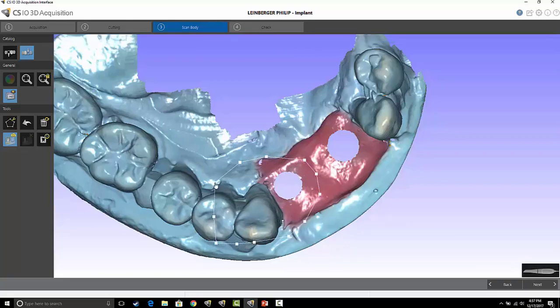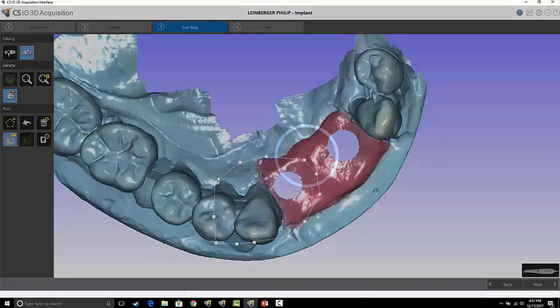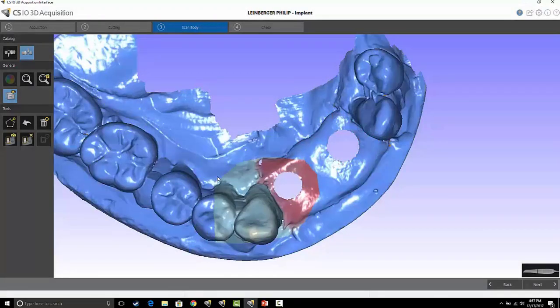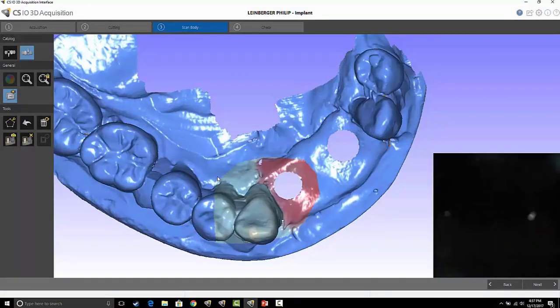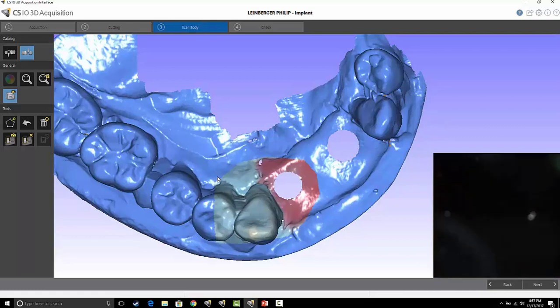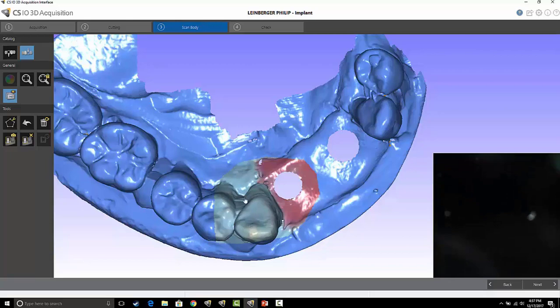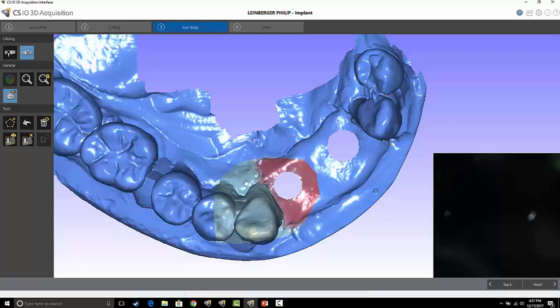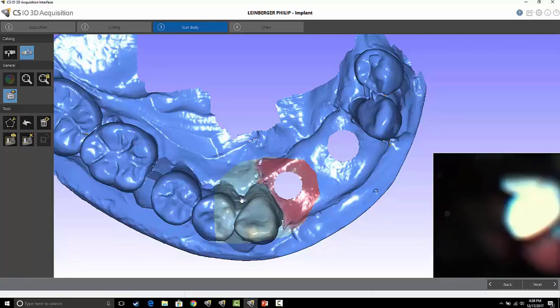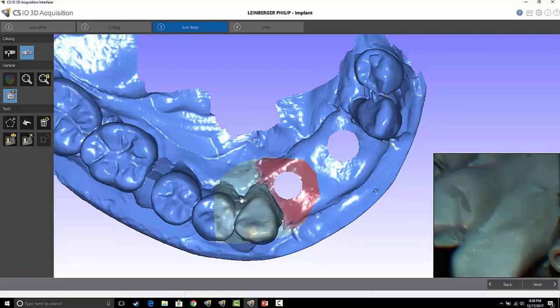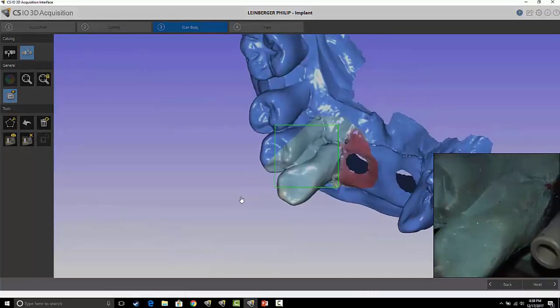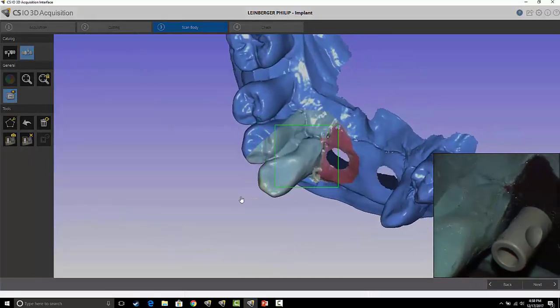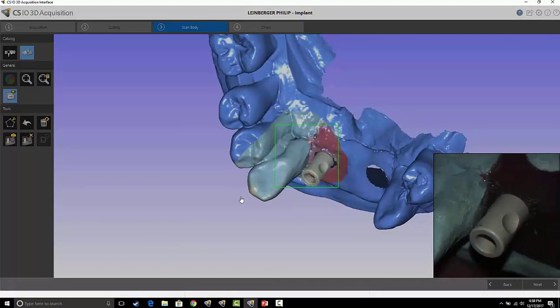Where I won't be able to add any more data. Now I can actually take and scan my first scan body. I'm using this area to re-register the scanner to the actual model. I can't just highlight just this area—it's not going to re-register the scanner. So I have to create a little bit larger area and use that one adjacent tooth to re-register the scanner, and now I can scan my scan body.